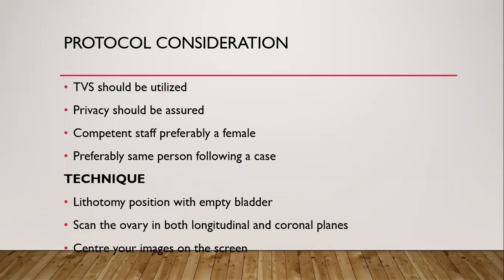For your own information, when you find a cyst on ultrasound transabdominally, and you also use transvaginally, you measure the same cyst, you realize that the measurements that you're going to take are not going to be the same. You can try that. I've tried it, and I've seen that most of the time the measurements we get transabdominally are usually less in terms of size.